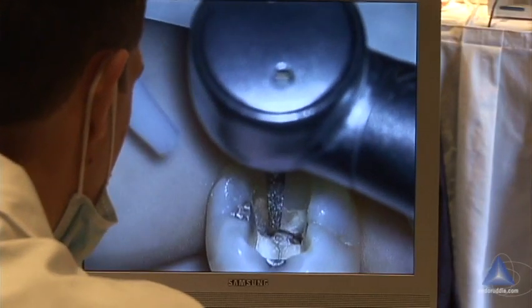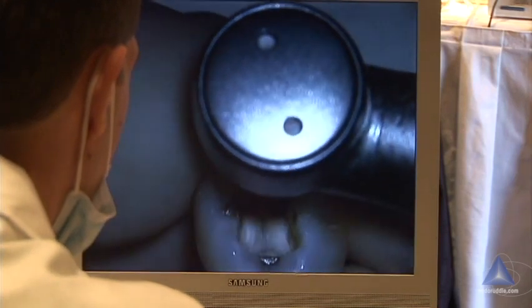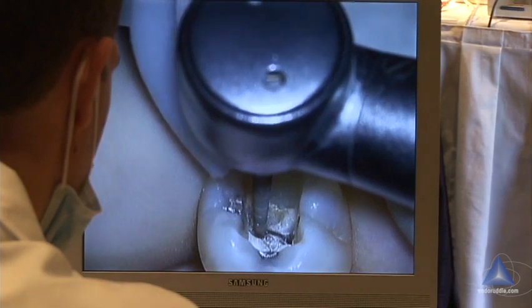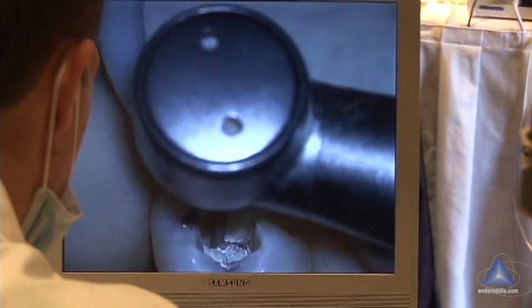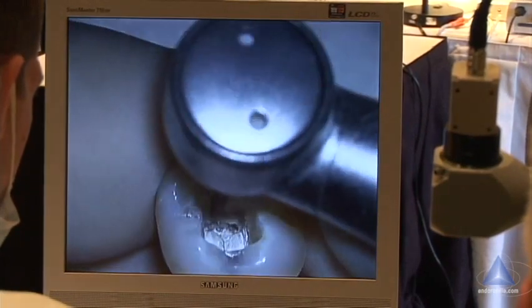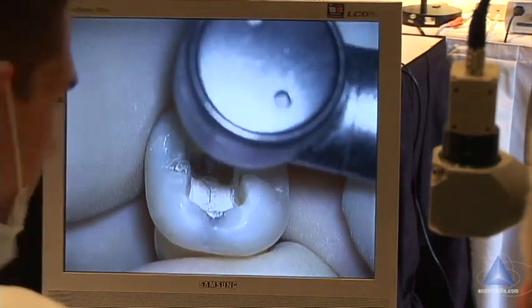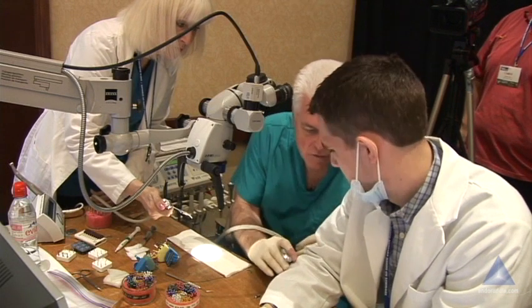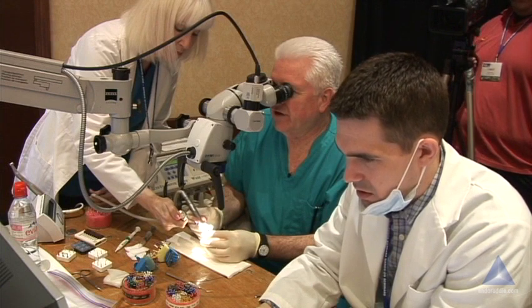We're going to do just a little job. Notice how little I move the tooth to start to see — that's just taking the patient's head and doing that a little bit. Now I have some little lips and stuff — we'll just get rid of that, then tip the patient's head a little bit and just buff. What if there was a canal in the mid mesial? We wouldn't have known the way it was. You can take the tip of your diamond — just going like a piece of sandpaper. I get a catch in the mid mesial there.